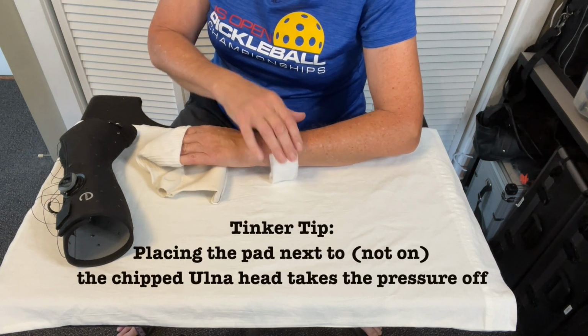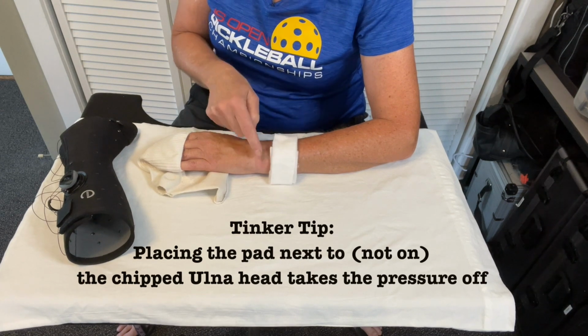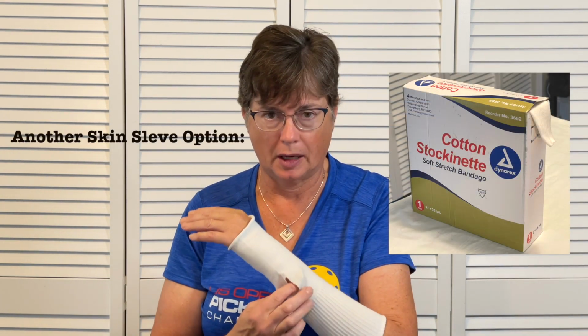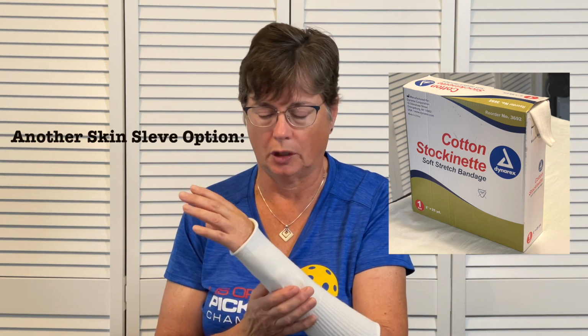So this was my MacGyver, my 50-cent fix. Just sacrificed a pair of socks. So again, it's a sock. Got a little hole for adding that padding to help relieve any pressure on where that little tiny chip is. And then I can slide it back on.